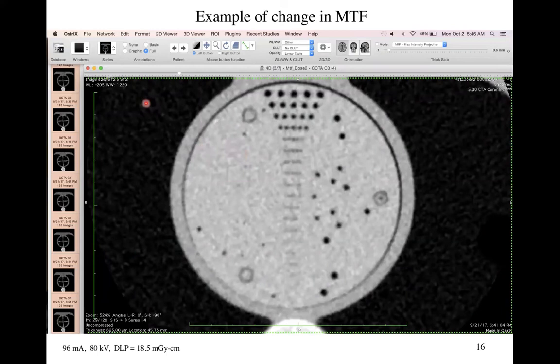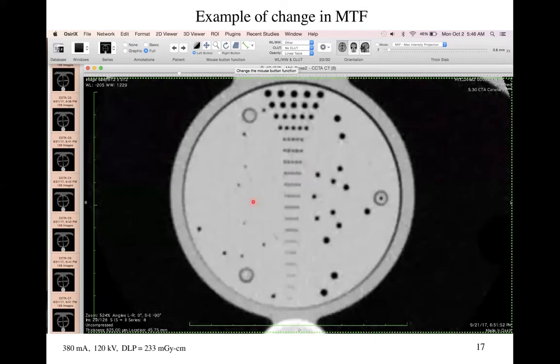So here is a CT image that's acquired with very few photons, and the reconstruction algorithm, in order to make a reasonable looking picture, actually averages the data together before making the reconstruction. You can see with this resolution phantom, which we had built in the machine shop here, at a certain spatial frequency these things are perfectly fine, but then as we go to higher and higher spatial frequency, basically it blurs into an averaged value.